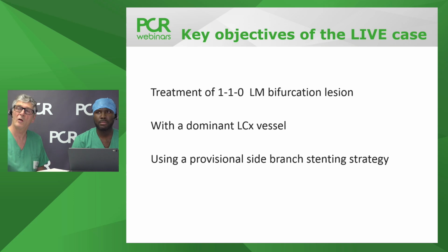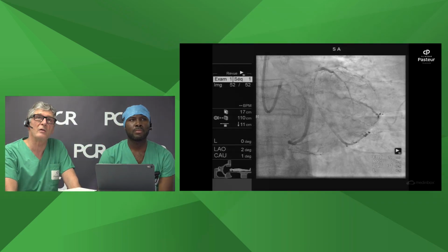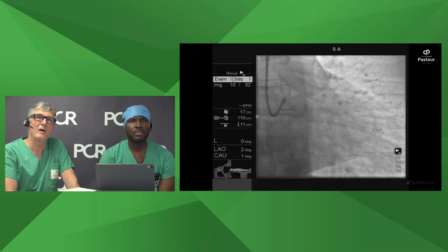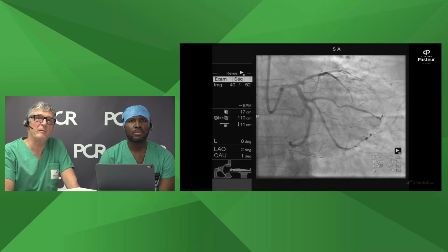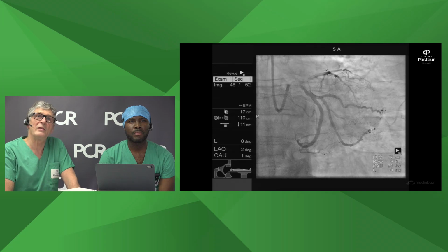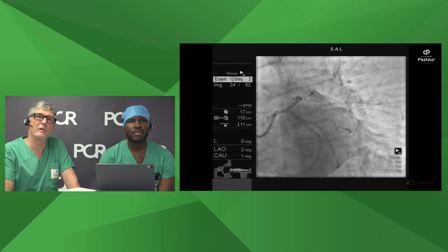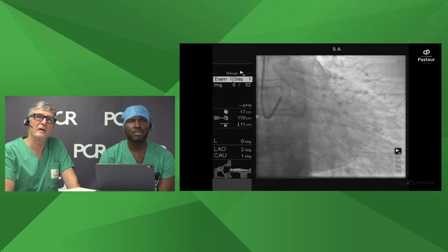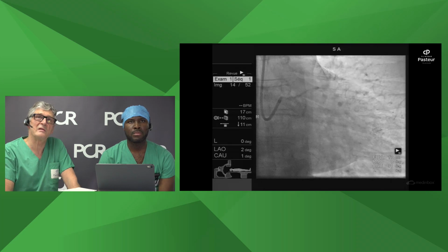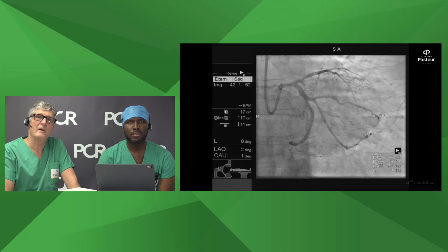And while you are asking questions, we can show the angiogram, which was already done by Jean Fajadet and Bruno Farah. You can see clearly that this circ is a very big vessel, at least 4.0, and this lesion of the mid left main and proximal LAD is seen clearly here.